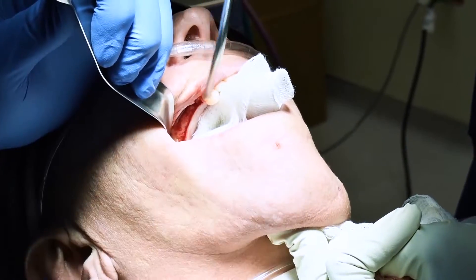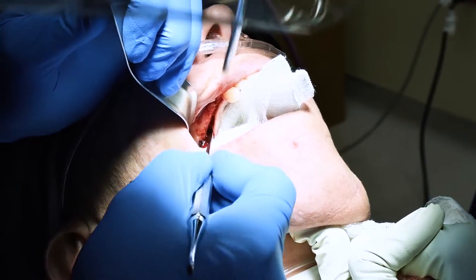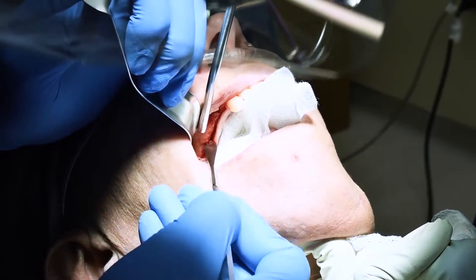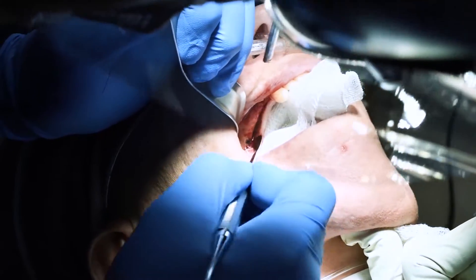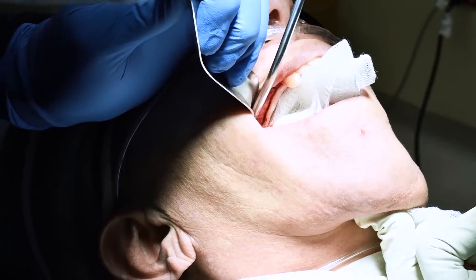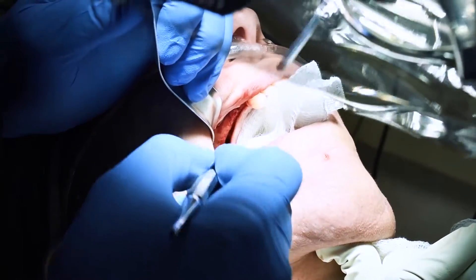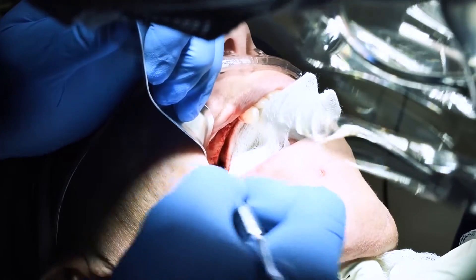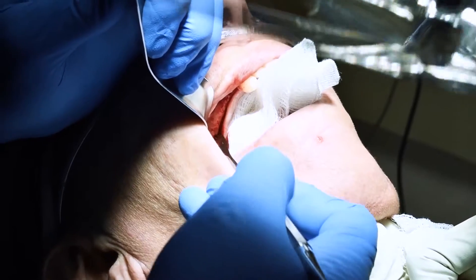That's probably like amalgam — probably amalgam from a previous filling. Oh no, it's not. It's suture. Did you see that? Oh wow. It's squeezed out. What is that? I don't know. It's not suture. It's coming out of that window. It's not supposed to be there though.